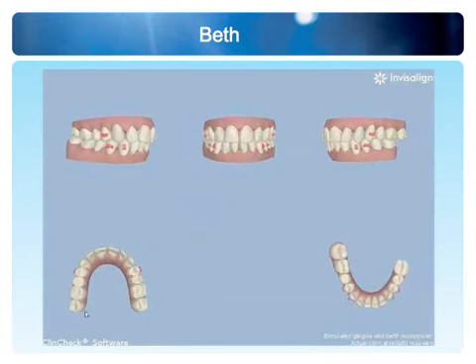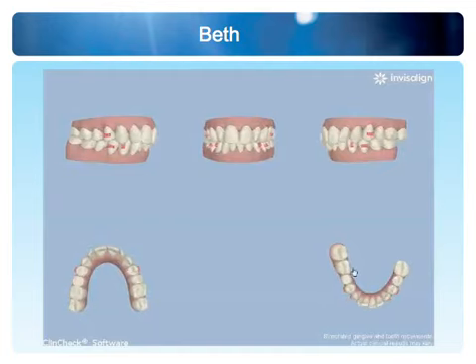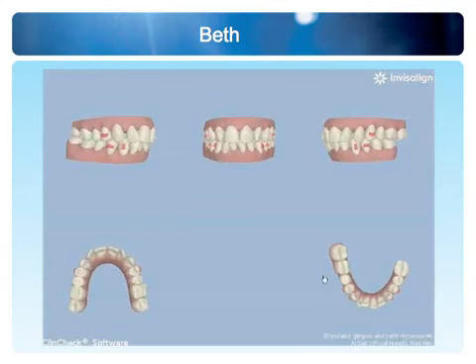So, as we play that view, we can see how that canine was brought into position and the lateral was then brought into position. And if this was a patient who walked in without any crowding, that's where the canine would be. But since the patient didn't walk in that way, upper laterals are rotated. The canine is mesial to where it should be. So we want to set all 14 teeth where they belong, and that's how upper laterals go into place beautifully.